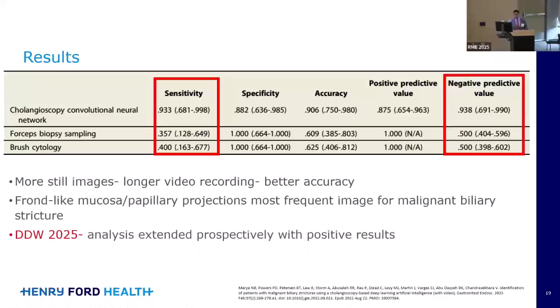And then they also presented some really interesting stuff at DDW, and expect more papers coming from this group, extending this analysis prospectively. I know I've sent Neil a couple of clips over email since we've connected, and asked him to plug my video into his algorithm to see what things look like. As someone who does a lot of cholangioscopy, I'm really excited to see where this goes. So this model is looking at cancer or not cancer without where to biopsy.